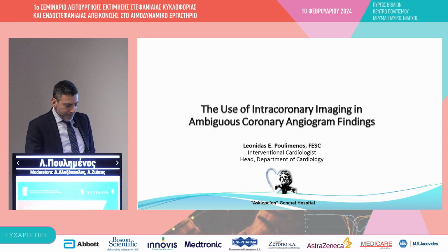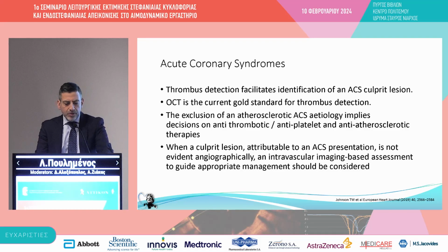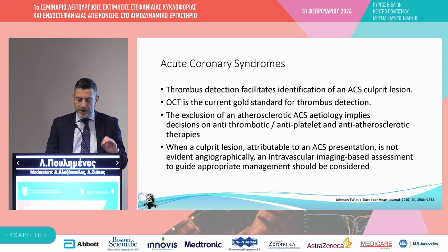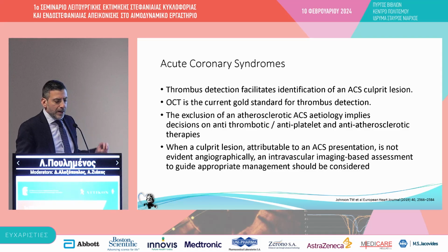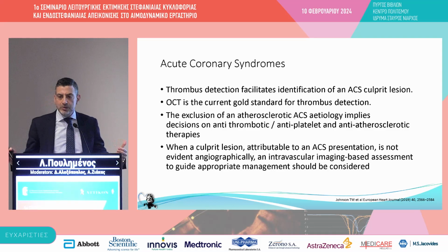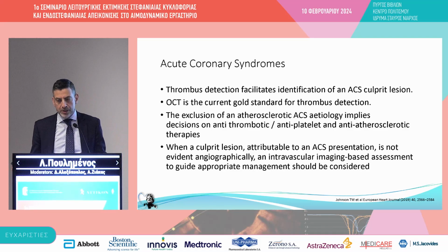Let's start from acute coronary syndromes. Thrombus detection facilitates identification of an ACS culprit lesion, and OCT is the current gold standard for thrombus detection. And this implies the exclusion of an atherosclerotic etiology and should lead us to decisions about antithrombotic, antiplatelet, or anti-atherosclerotic therapies.